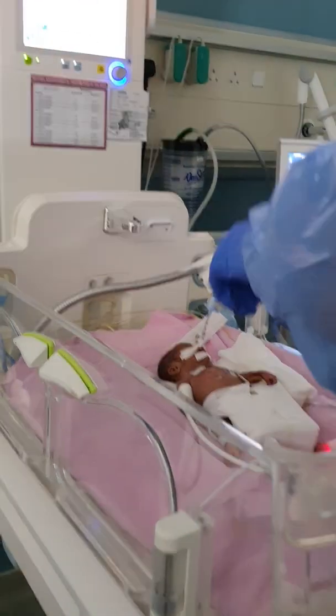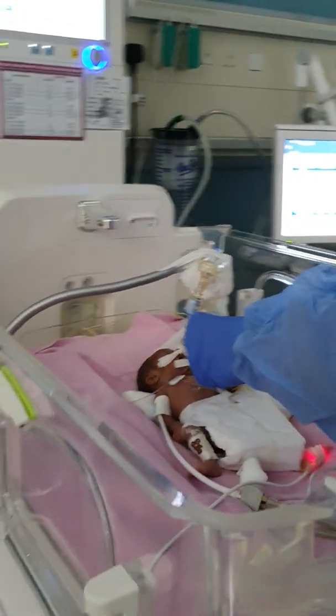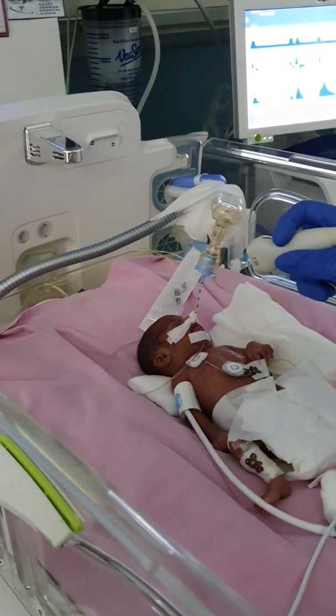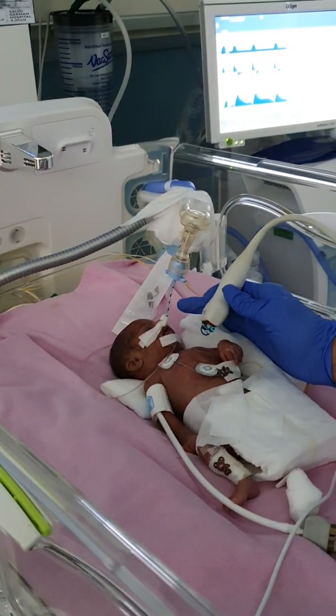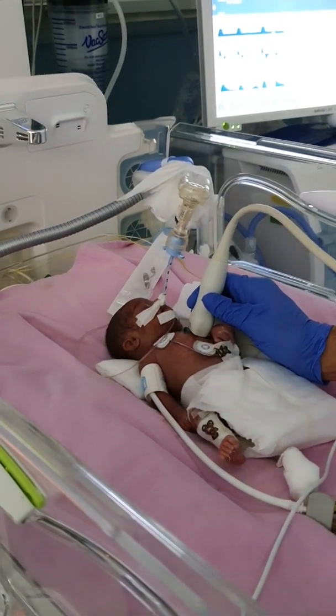And usually I start by the apical view, and for the apical view I go like this, again holding it with two fingers and resting the hand so I don't press on the baby, and then I continue my scanning.